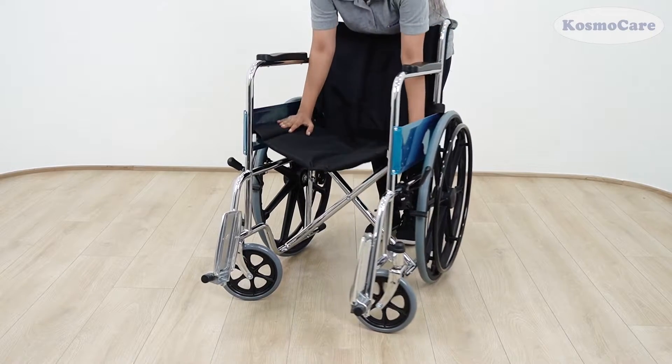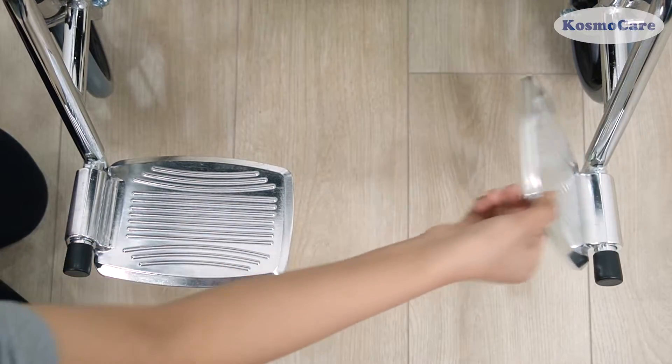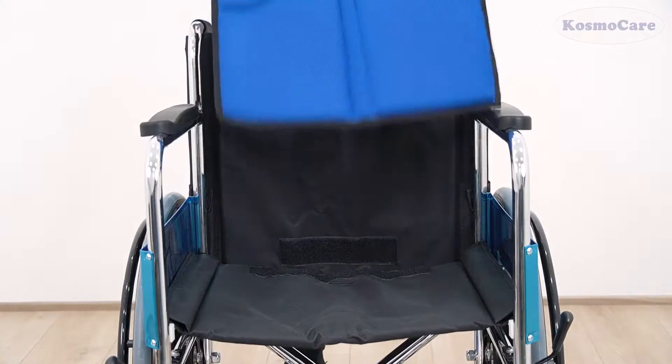The wheelchair comes pre-assembled. Simply push down on the sides of the seat to unfold the wheelchair and rotate the footplate inwards.